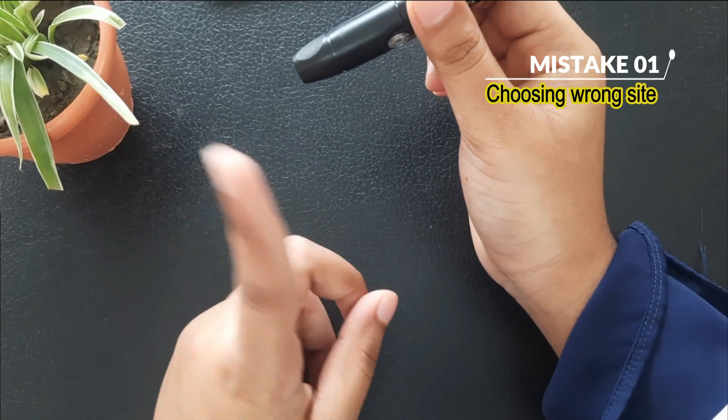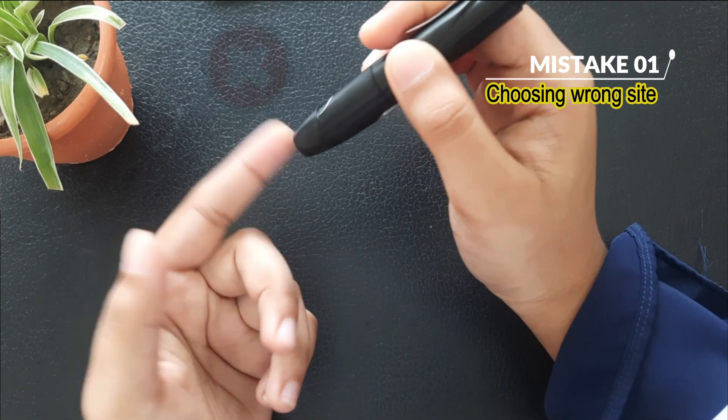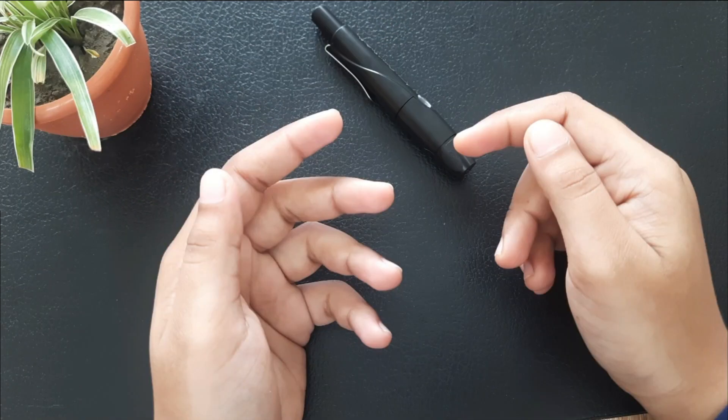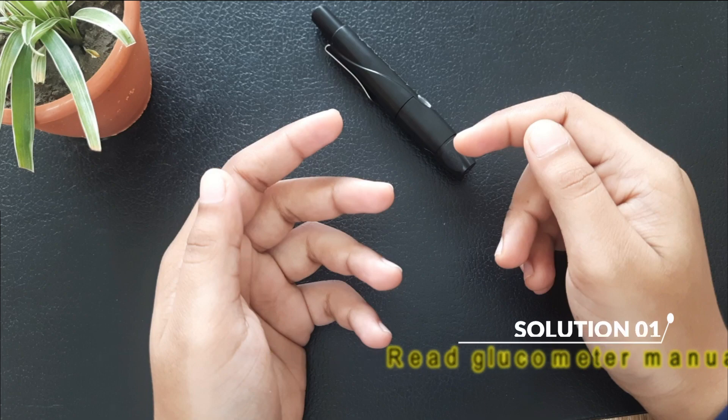Mistake 1: Choosing the wrong test site like tip of index finger. Solution is, read the glucometer's manual. It will list approved test sites.